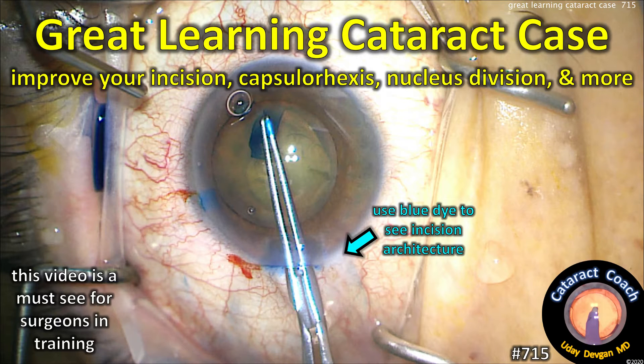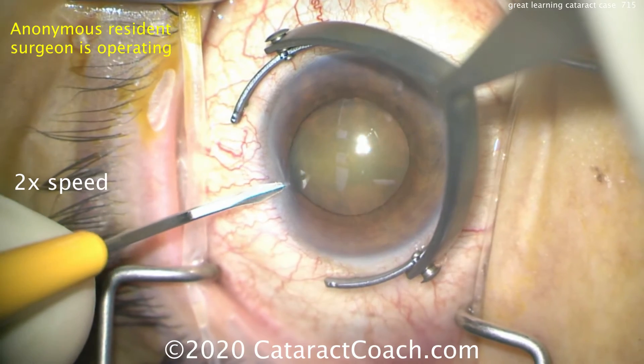CataractCoach.com. We have a great learning case here — improve your incision, capsulorrhexis, nucleus division, and more. This is a must-see video if you're in training.